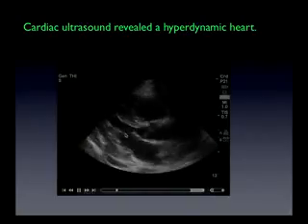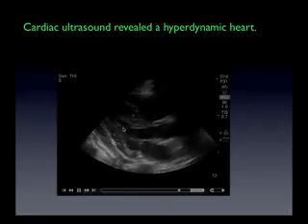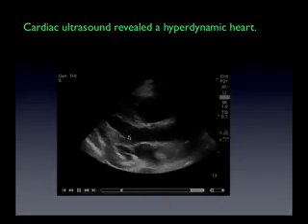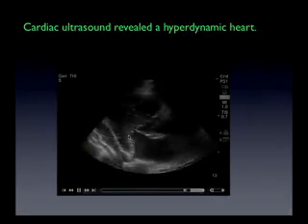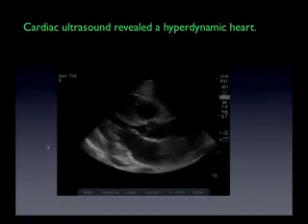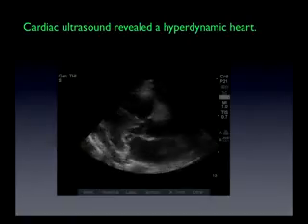If we look at the space that is the cavity over here in the left ventricle, we can see that there's essentially total obliteration as the heart is beating. This is a hyperdynamic heart. Hyperdynamic hearts are commonly seen in patients with dehydration.